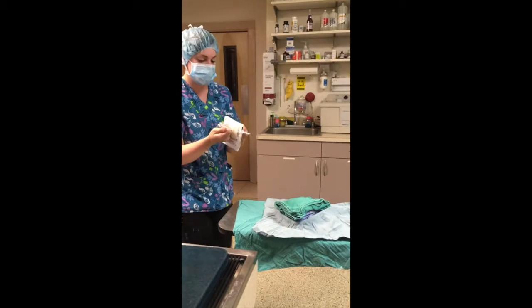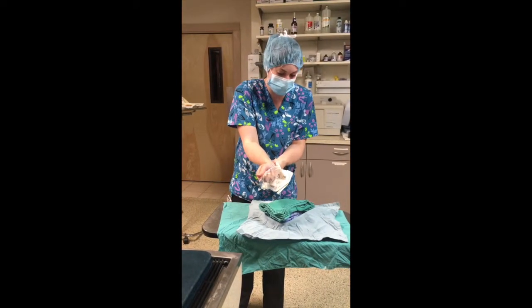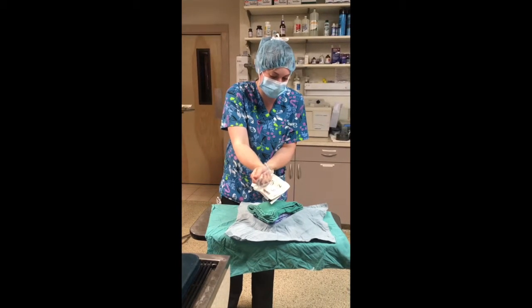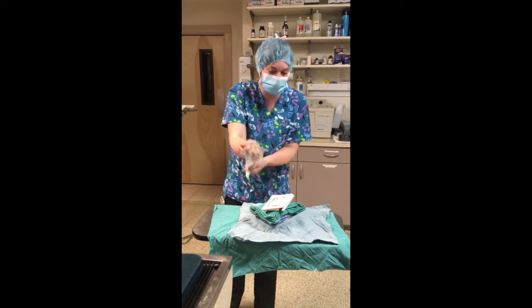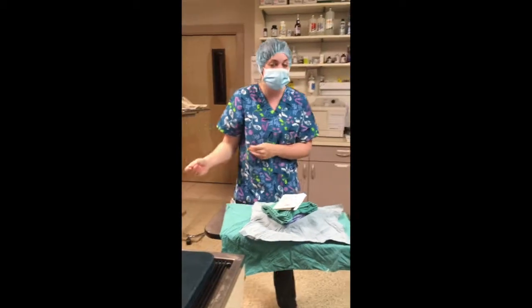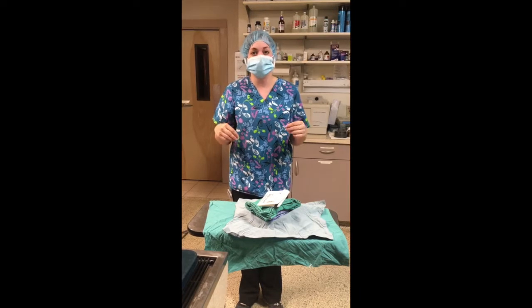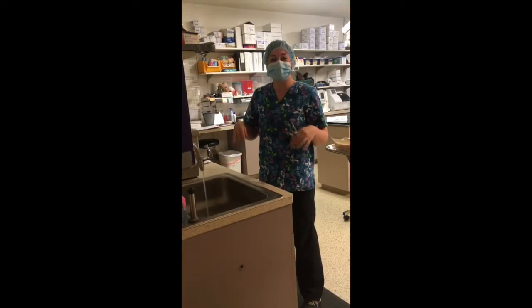And once that's open, I'm going to go ahead and gently drop that. So now those are all sterile and they're ready for me to scrub up, and then I will come back and grab everything that's sterile. All right, now I'm going to do my surgical scrub.